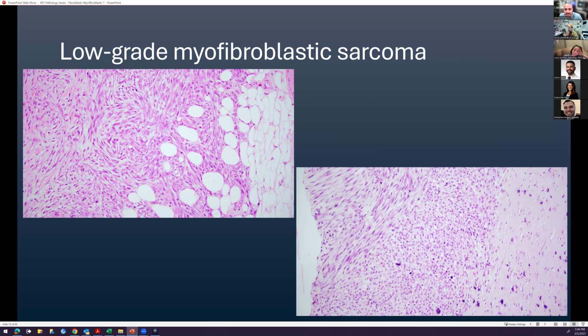So a number of myofibroblastic tumors, because you can see it has that nice amphophilic stellate cytoplasm, right? Of a myofibroblast. So you can tell it's myofibroblastic looking. But, for example, some variants of nodular fasciitis could be a little bit infiltrative. Could this be a proliferative fasciitis? Could this be something in that spectrum? There are certain types of those tumors that are much more cellular and have a lot of mitotic activity, right? So it's really left up to there being some significant atypia, at least focally, for it to really be called low-grade myofibroblastic sarcoma.